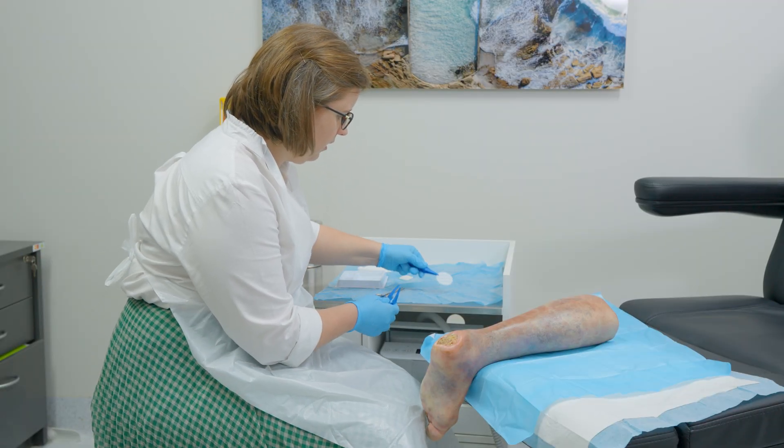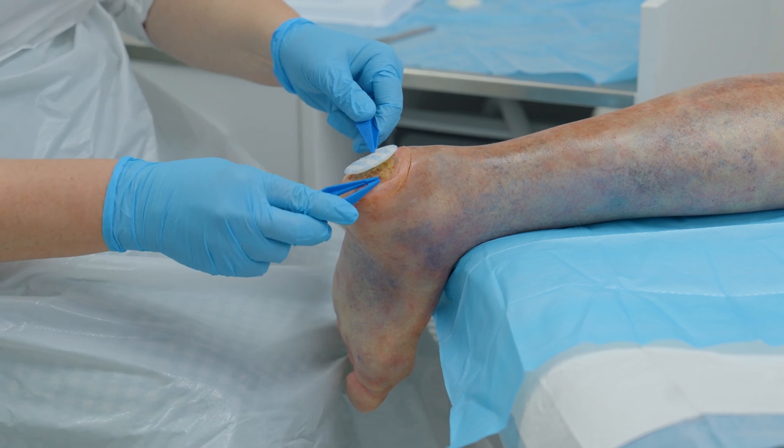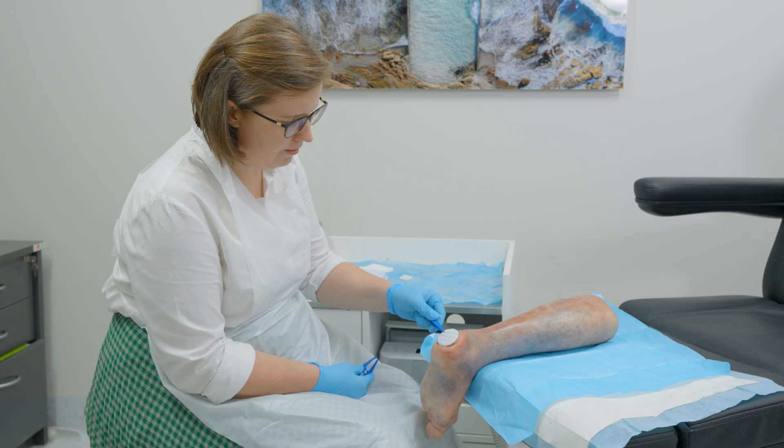When using this dressing we need to protect the skin around the wound. When applying the dressing the white side should be facing the wound. We use this in combination with a super absorbent dressing.